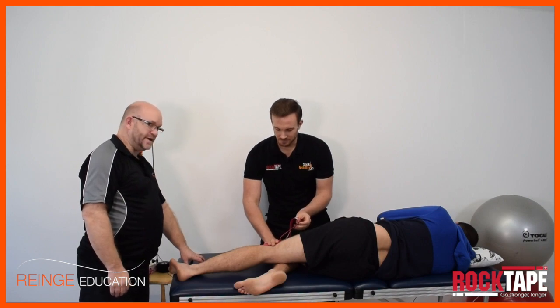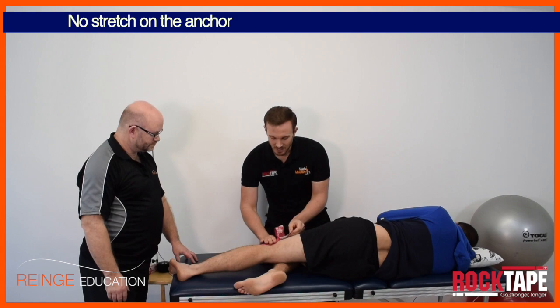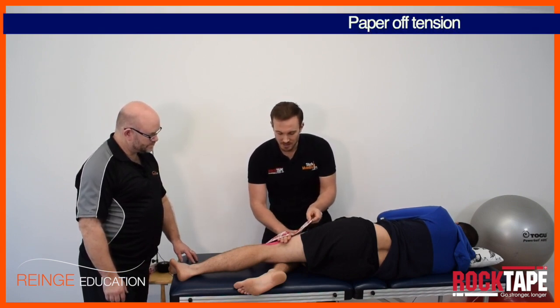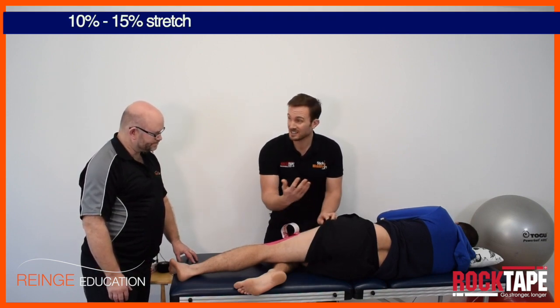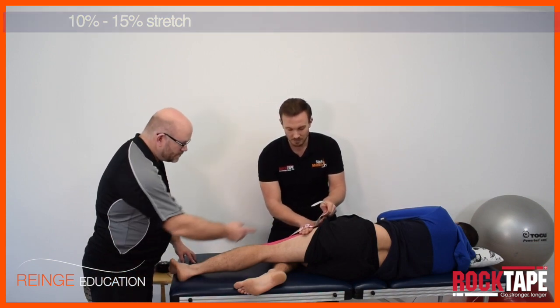No stretch on the anchor, as usual. Quite right — no stretch on the anchor, and then I'm doing what we call paper-off tension, which is simply sticking the tape down as it peels away from the backing paper. That gives about 10 to 15 percent stretch — there's a little bit of stretch integral in the tape as you take it off the backing paper.